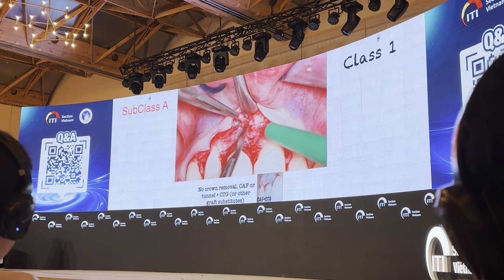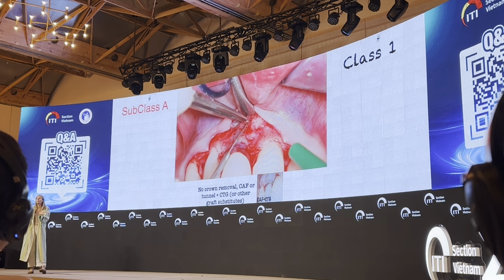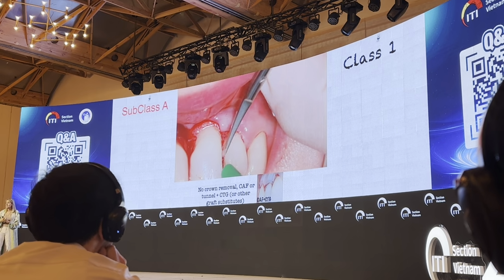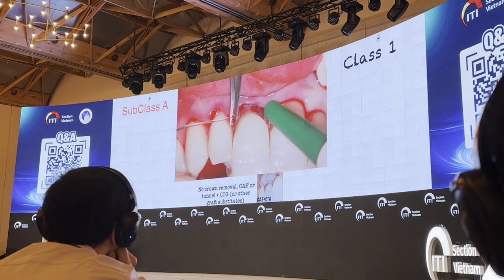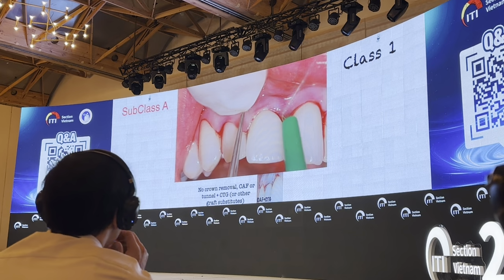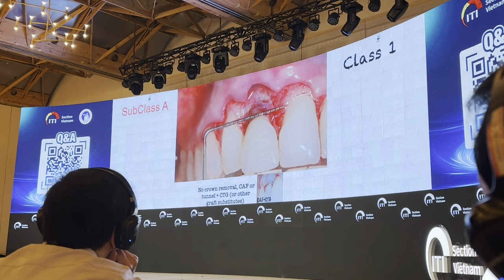So how to avoid the connective tissue graft exposure? To avoid it, what you need to provide is complete coverage of the graft with a flap that is stable and tightly stabilized around the convexity of the crown of the implant-supported restoration, with complete stability of the bleeding. Only in that way can you be quite sure that the graft is going to remain covered, thanks to the complete absence of tension in your flap, and it is not going to be exposed.